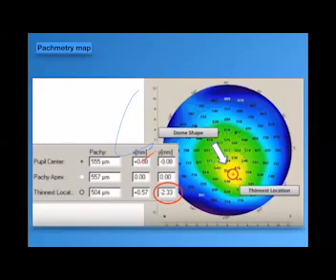Before going to the pachymetry map, in the elevation map you will study the numbers and the sign of the numbers, plus or minus, and the correlation between the posterior and the anterior elevation with other figures. Also the appearance of the color code scale of this patient.